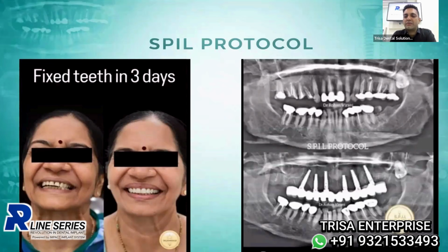Now why DSI? Because obviously she's undergoing multiple extractions, some filled endodontic teeth, some mobile teeth, some broken teeth. However, there was no need for a pterygoid implant, no need for removing the wisdom tooth, because the zone A and the zone B, that is the pre-maxilla, allowed us to successfully place long two-piece implants which allowed retrievability and also allowed us to avoid a pterygoid or a zygomatic implant, yet giving her an immediate load solution which could be retrieved at a later date to compensate for the tissue shrinkage.